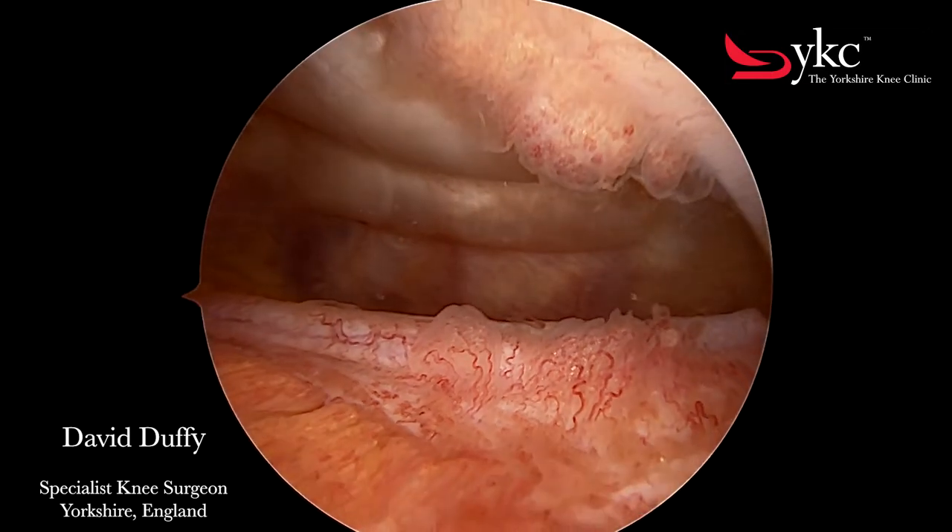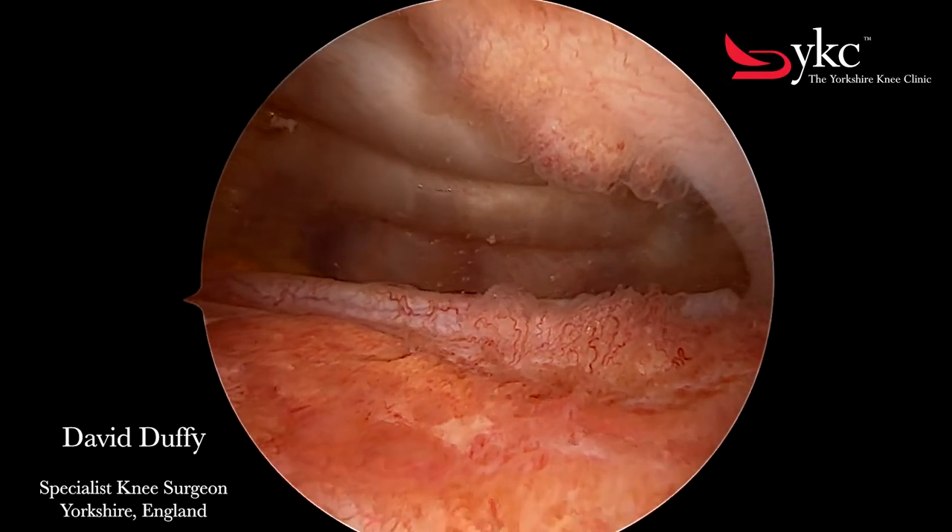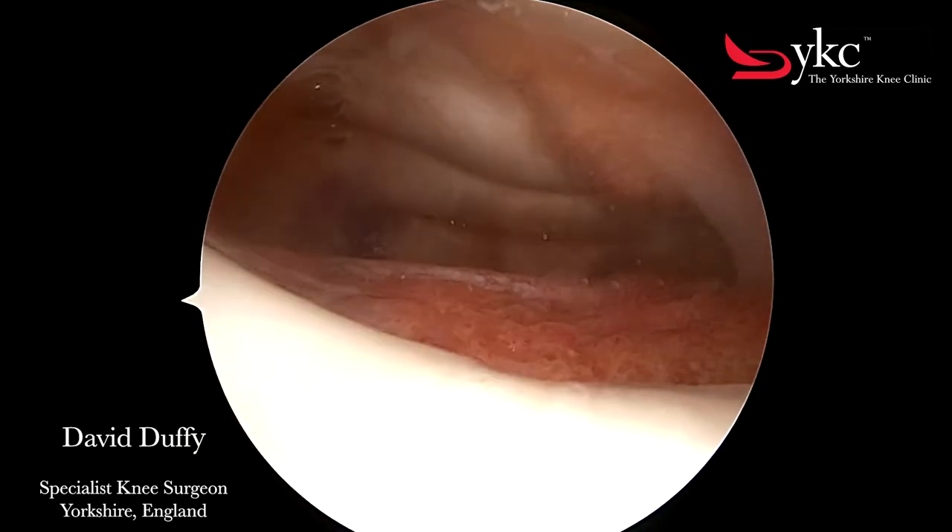It's the synovium that produces the lubrication of the knee, and here you can even see the individual blood vessels running through it.